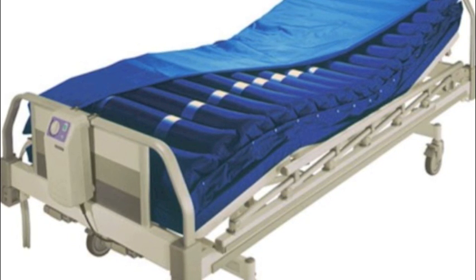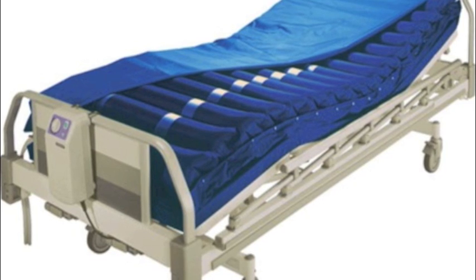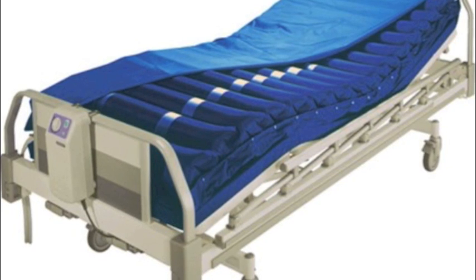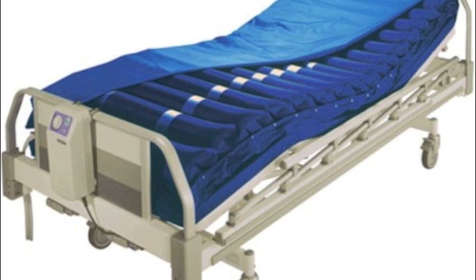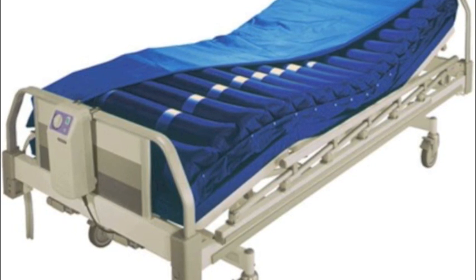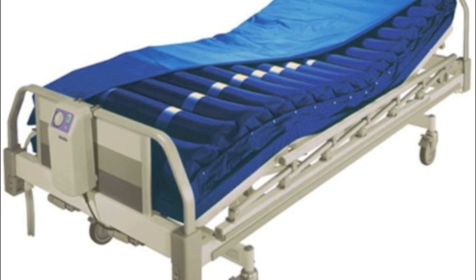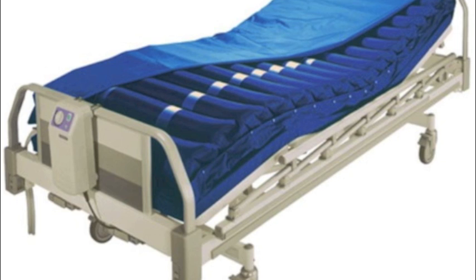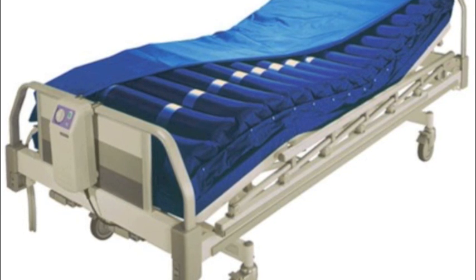Most systems come with an air pump, which also functions as the control unit, a mattress pad, the air mattress itself, which comes deflated, the hose which connects the bed to the pump, and a protective cover for the mattress. For the purpose of this instructional video, we will discuss how to assemble the Rojo mattress. Although it may have some differing aspects than the other beds, the principles of setup will remain the same.